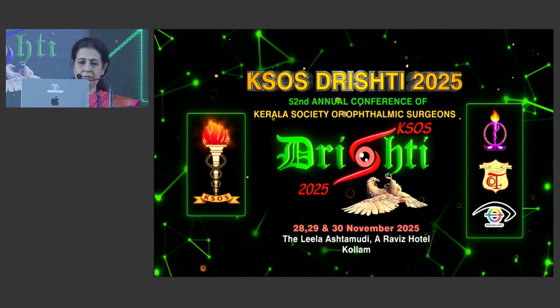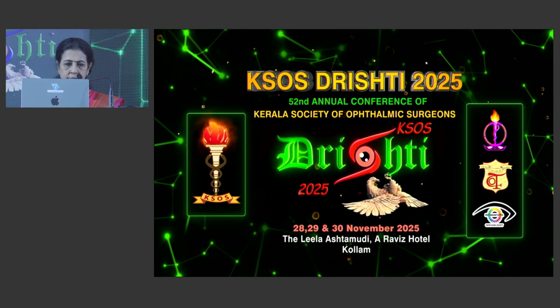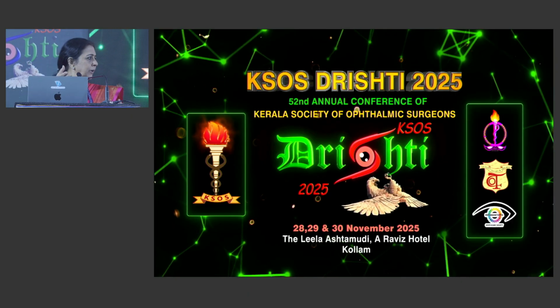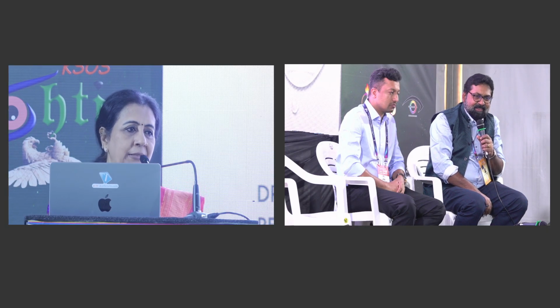Thank you, Dr. Chitra, for that, as usual, wonderful presentation. I only hope more of us can afford OCTs. Even the IOL Master OCT will give us an idea, and I think maybe it's the next thing. It will help us a lot. Even if you presume it's grade 1, and we treat it as a PPC and don't do a hydrodissection, it's okay. It's just that the surgery can go faster, because you're overcautious in a case where we need not be.